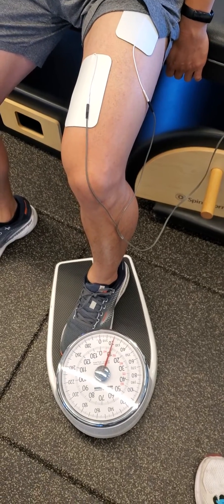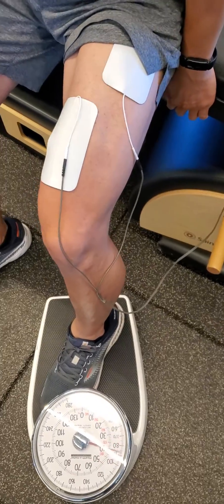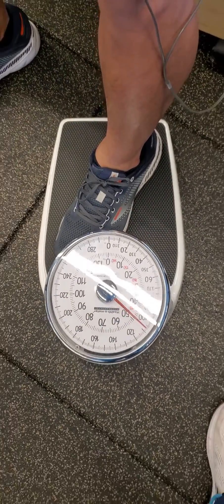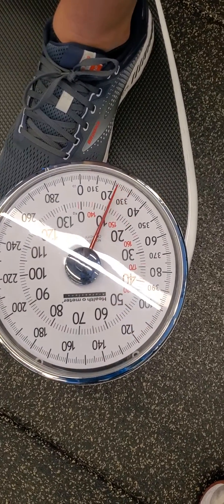We're looking at forced quad use after knee injury. We have the stim going as high as we can tolerate, and then we're forced using the quad by driving into the scale. We're at 120.